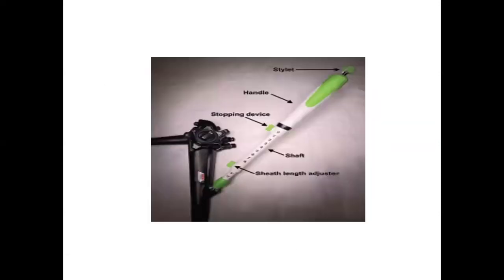So this is a needle that we use in endoscopic ultrasound. This needle has a handle. This whole thing we are seeing is a handle. The way we operate it, because we use it for a biopsy, it sucks contents of a lesion by capillary action. So when you move this green handle down, it sucks, just like that. I'll show you. I have a sample here, which I can use to demonstrate.